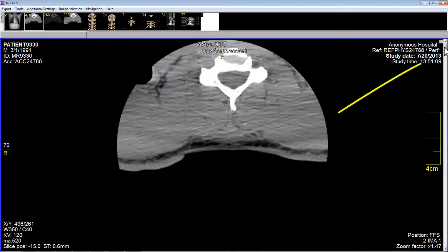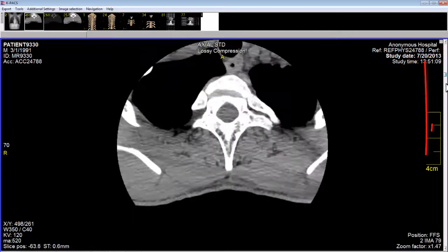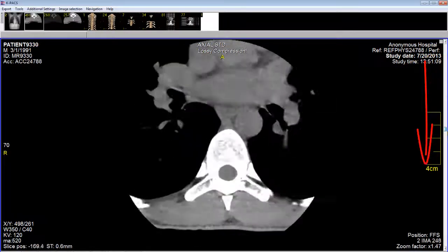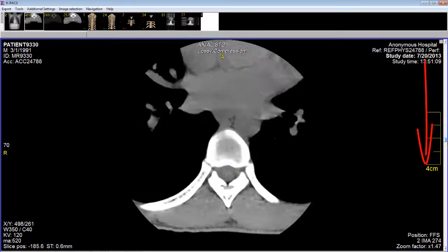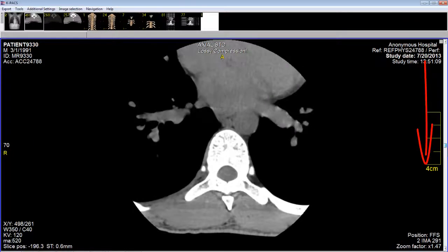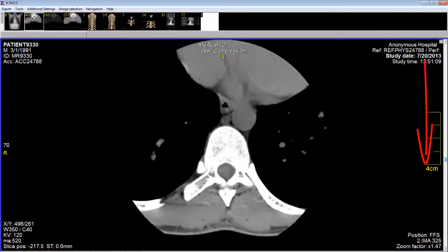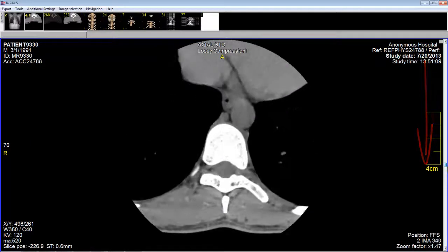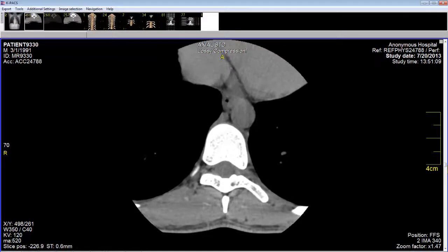Now, if I want to scroll through these sections, I'll go to the scroll bar over on the right, pull down, and I can go right into the middle of the axial sections. This ends the tutorial on loading and using KPEX.